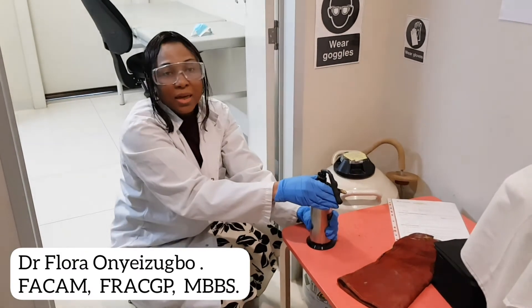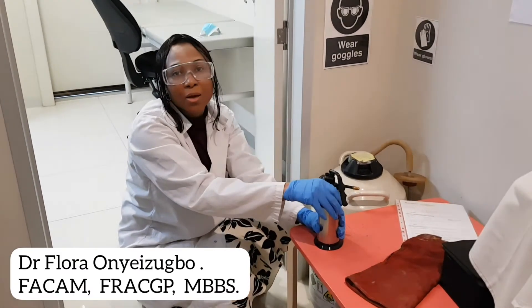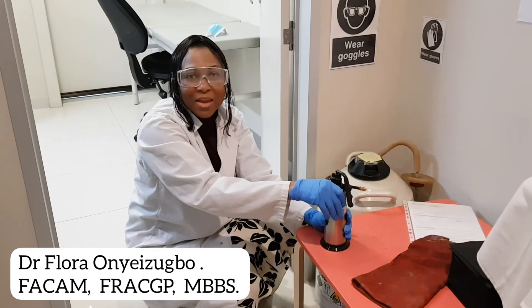So this is just the technique on how to fill up liquid nitrogen. I hope this helps someone. Thank you for listening.